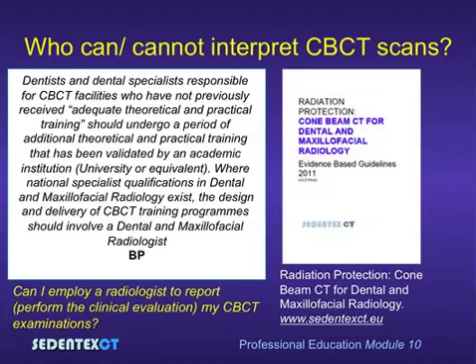A dentist with a cone beam CT scanner in his or her practice might well ask the question, can I employ a radiologist to report, i.e. perform the clinical evaluation, my cone beam CT examinations? The answer to that question is yes, subject to the availability of a radiologist and the financial support required.